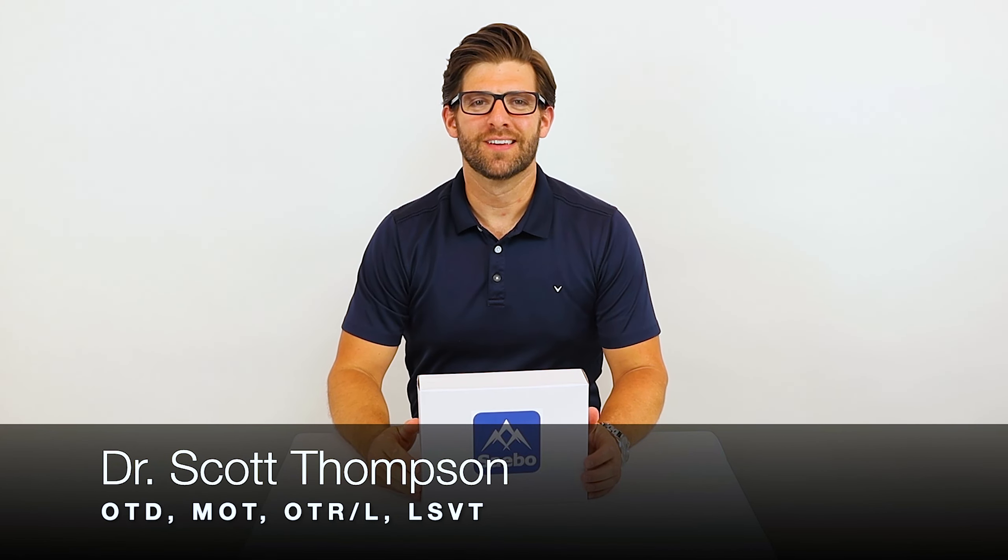Hello everyone, Dr. Scott Thompson here, and today I'm going to be showing you another product in our electrical stimulation line, the SaeboStim Pro.